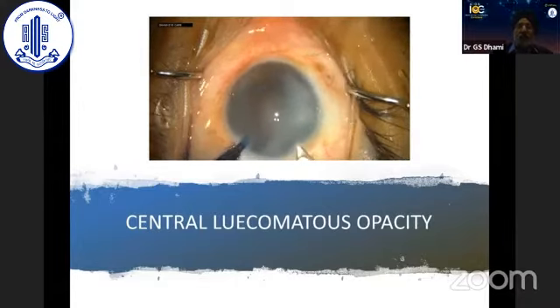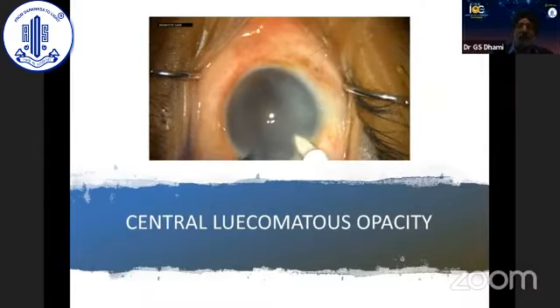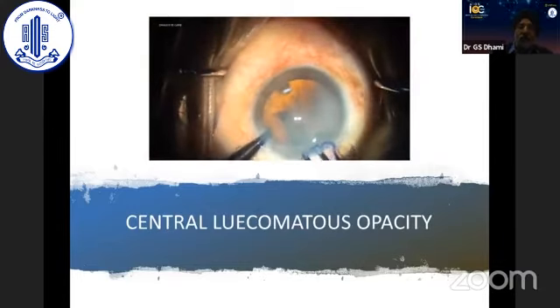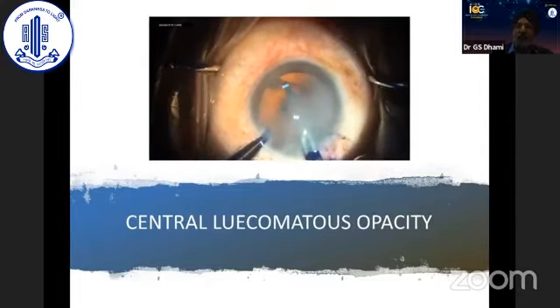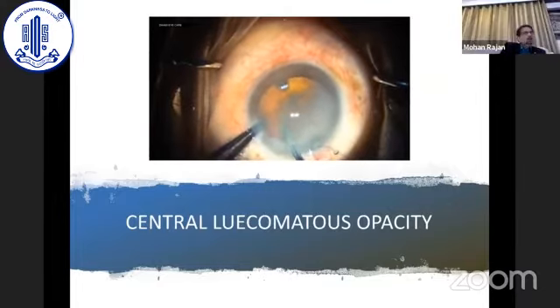Visual clarity can be obtained by repeatedly putting viscoelastic on the cornea. It gives magnification, a better view, a better transparency, of course not very good, but definitely better. And the rhexis has to be completed in one go. That's one thing you cannot miss.